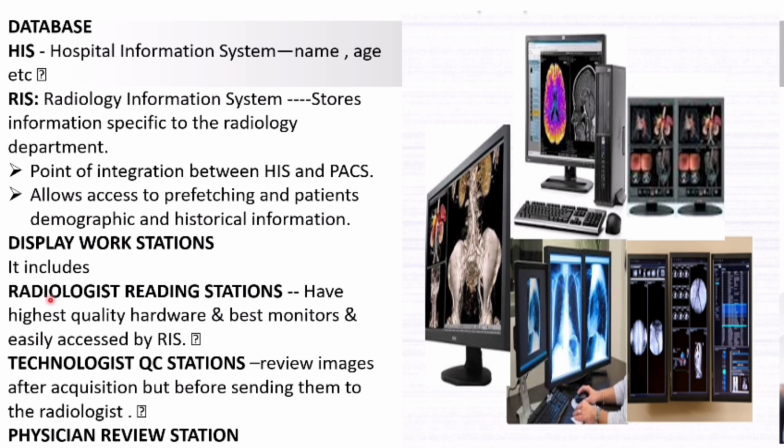It includes radiologist reading stations, which have the highest quality hardware and best monitors and are easily accessed by the RIS. Now we have technologist QC stations, in which the technologist can change the contrast and can do other changes before sending them to the radiologist. Then we have the physician review station.